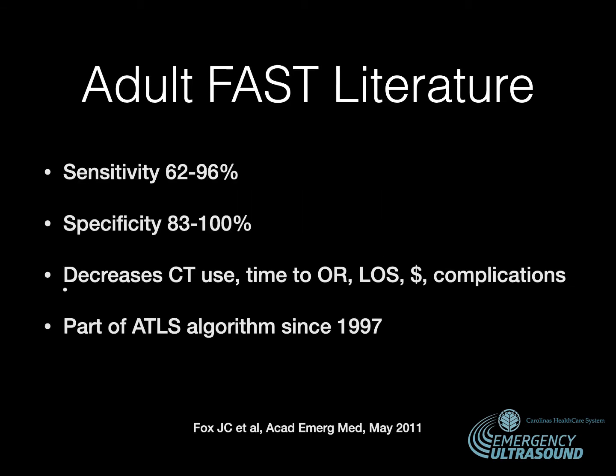So what's the literature on this? We have the sensitivity as 62 to 96% and specificity of 83 to 100%. Of course, this depends on the experience of the person performing the exam. It decreases the CT use, it decreases time to the operating room, length of stay, and complications, and it's been part of the ATLS algorithm since 1997.